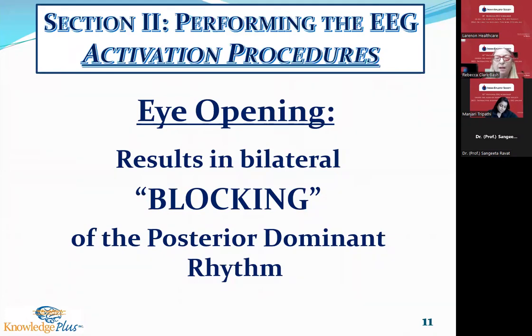Now, I just want to say one thing about this blocking effect. If the patient has unilateral PDR, posterior dominant rhythm blocking, and that would mean over the occipital head leads O1 and O2, it would mean that the patient opens their eyes and the posterior dominant rhythm is only present on one side. If that were to happen, and it were the only abnormality in the recording, it is not considered significant. The same will be said for unilateral photic driving. Again, if it's the only abnormality in the recording, it is not considered significant.